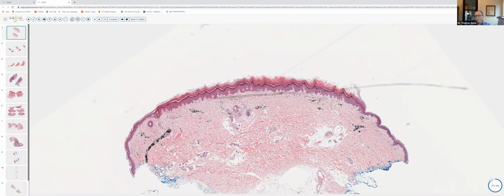And then obviously what catches your eye in the dermis is extensive granulomatous inflammation. And the granulomatous inflammation is surrounding these round, kind of brownish gray spherules. Sometimes this material can be more blue-gray than brown-gray, and it can also be calcific.